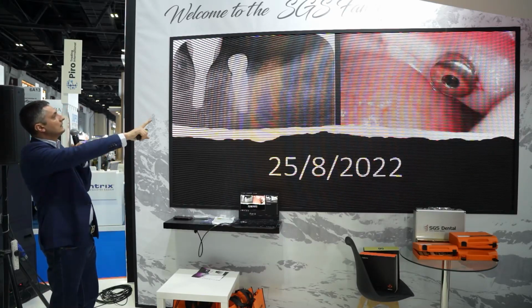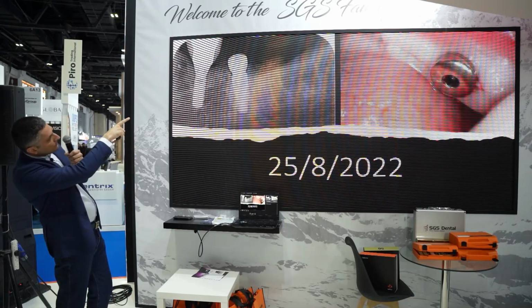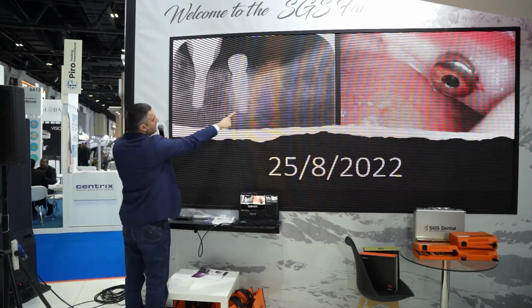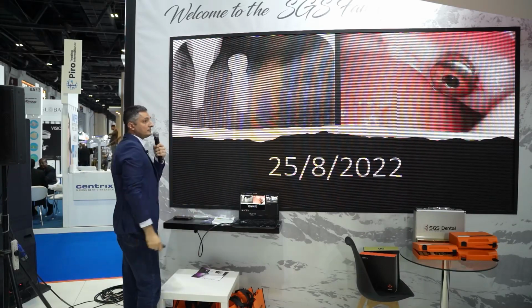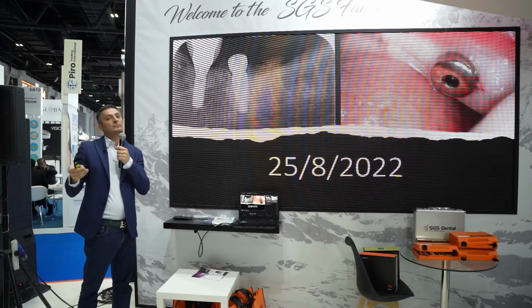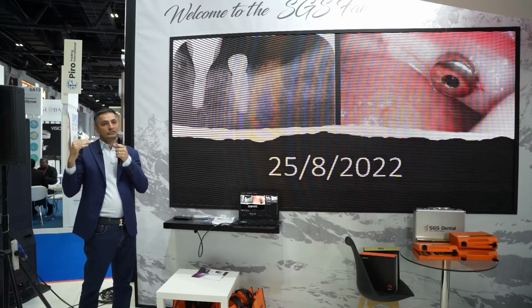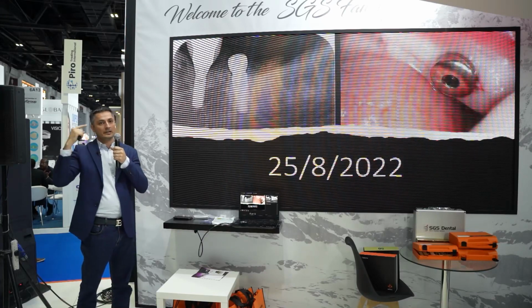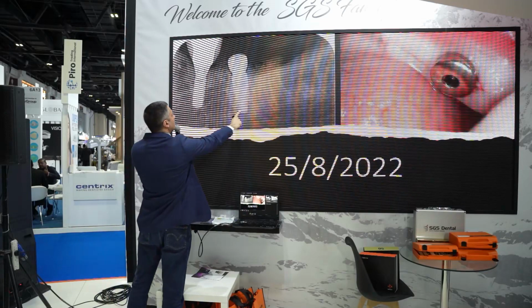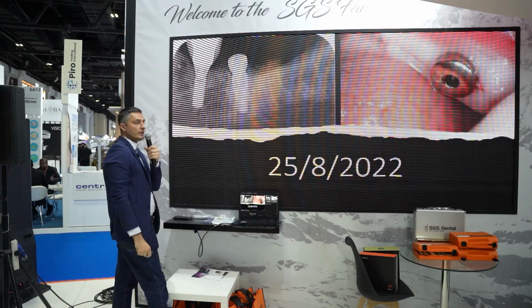This is the second stage. We can see the bone in the distal root. Okay, we can see a black hole here. While I'm drilling, I go further 0.5 millimeter to 1 millimeter to have the chance to get the implant deeper, below the crest 1 millimeter. So I count for this before putting the implant. But don't be afraid of this one. This one, it will heal after. I will show you in the x-rays.